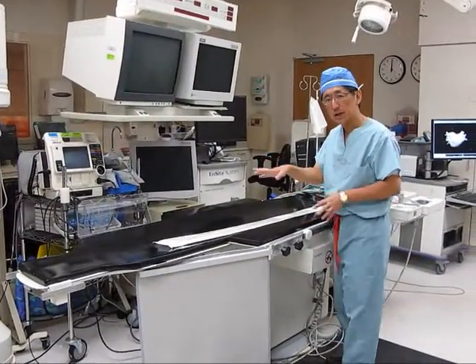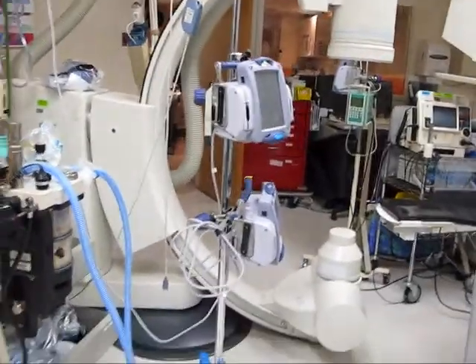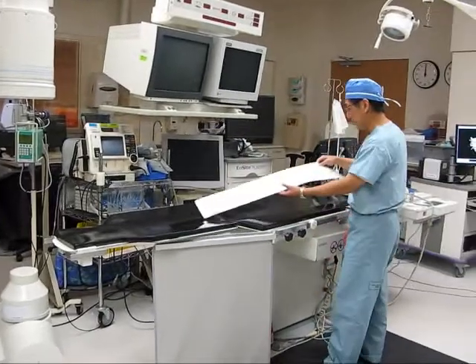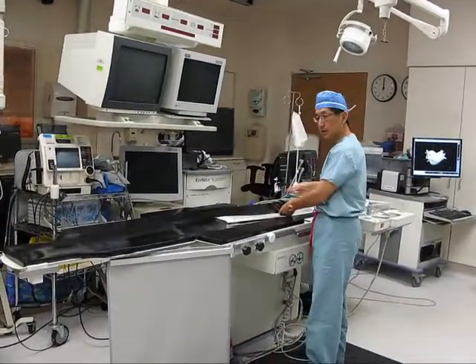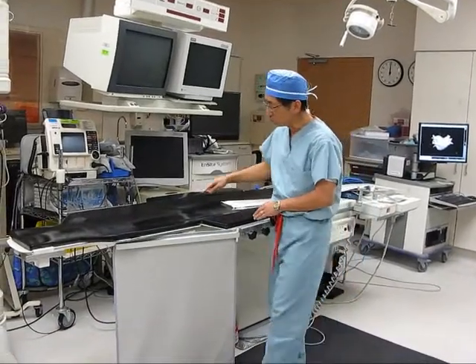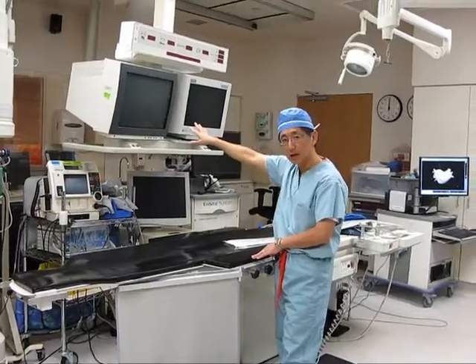Generally, this is done under anesthesia. The anesthesiologist will be sitting here administering general anesthetics. Once the patient goes to sleep, we put catheters such as this one through the leg, and the catheter will travel up to the heart. We can image the catheter directly on our TV screen.